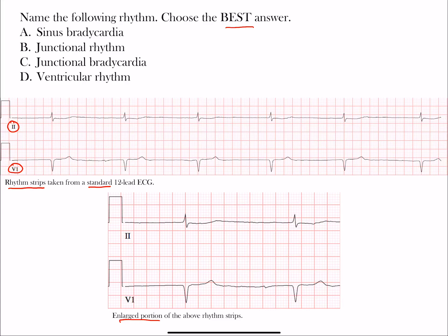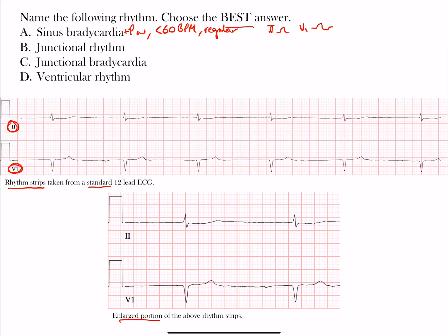Hopefully you had a chance to give it a shot. We want to walk through each answer choice and understand why each is correct or not — there's only one correct answer. So our first answer choice is sinus bradycardia. Things to know: P waves are present, the rate is less than 60 beats per minute, it's a regular rhythm, and those P waves tend to be upright in lead 2. In V1 you may see positive-negative biphasic P waves.